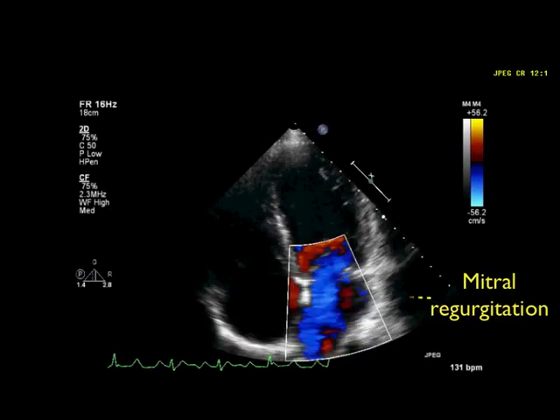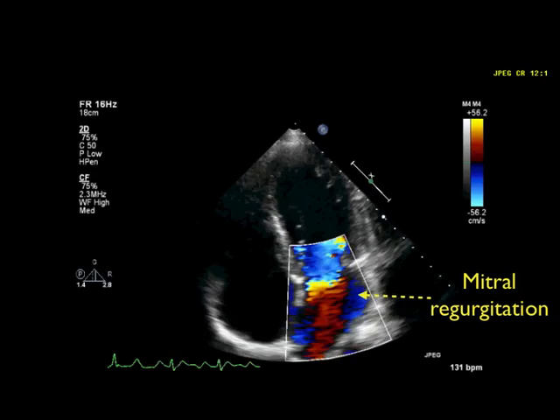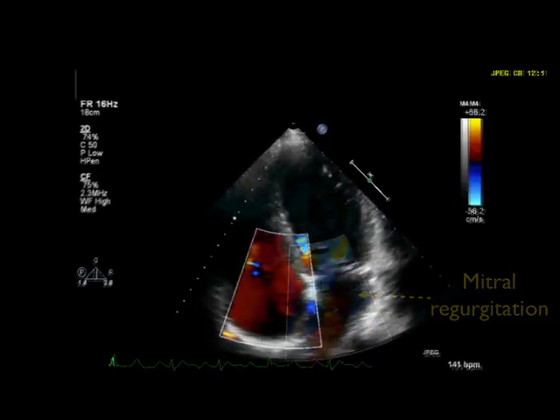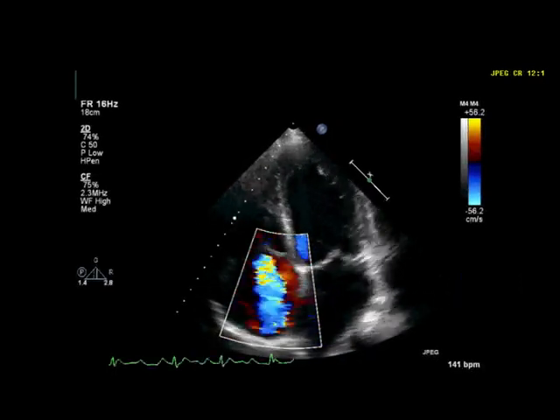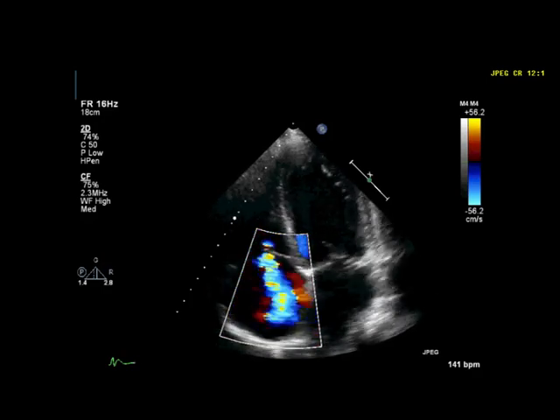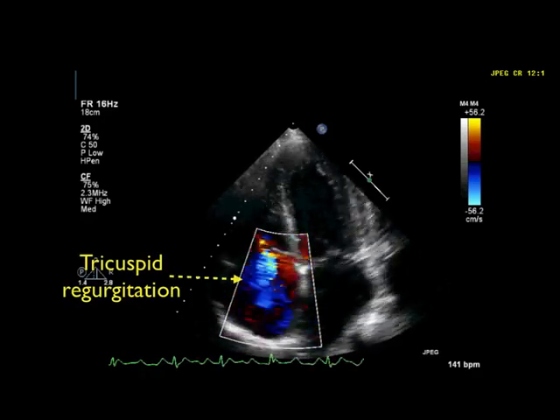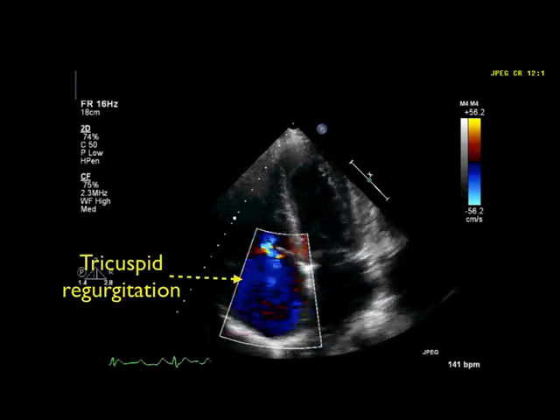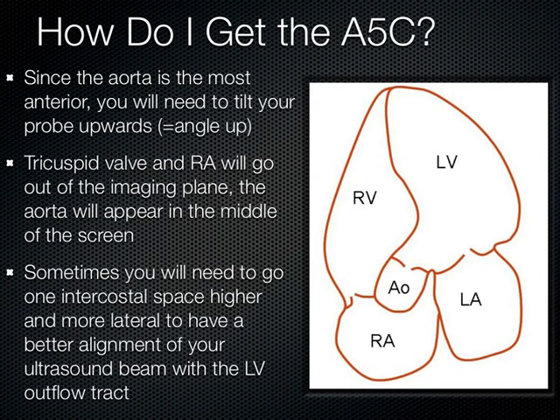Here's another example of a blue jet hitting the back wall of the left atrium. We can also see it on the tricuspid side, so you can evaluate both the mitral and the tricuspid valves in the apical 4 chamber.